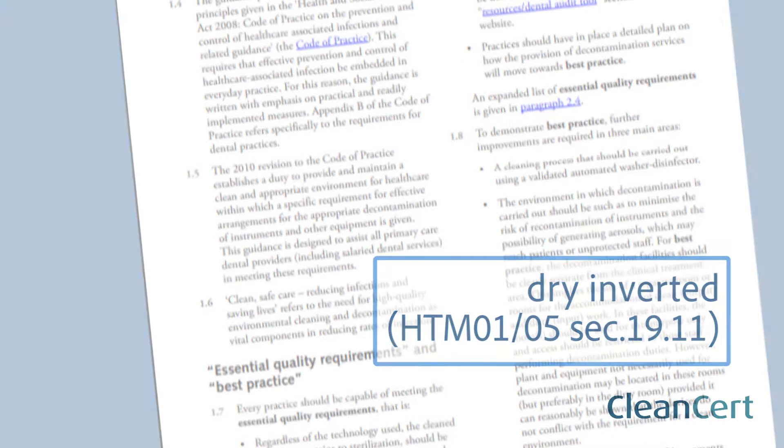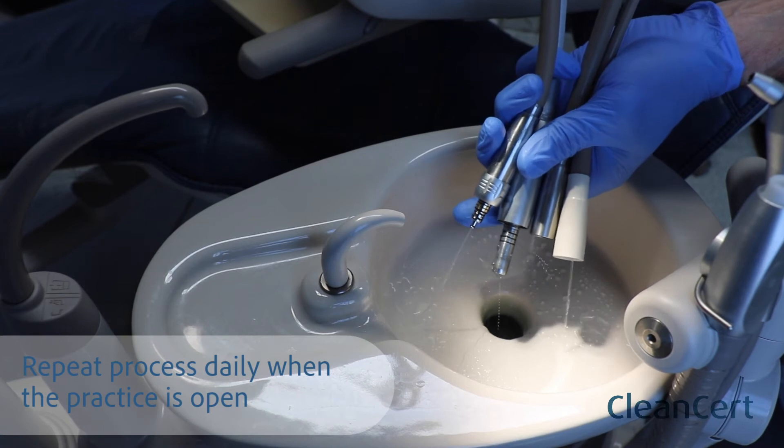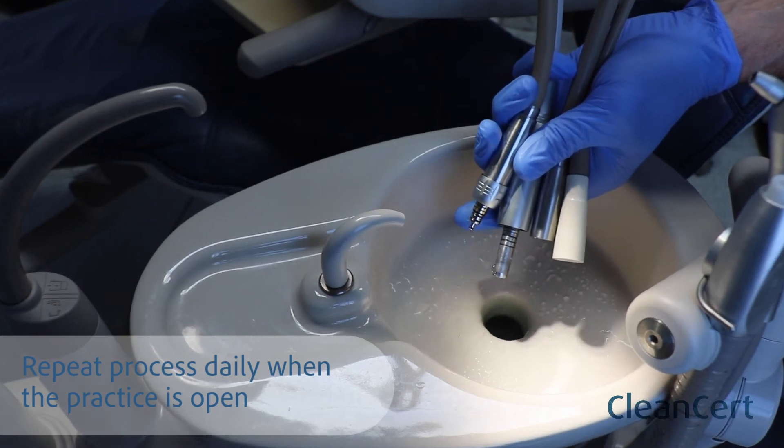Finally, purge water lines of any remaining liquid and allow to dry overnight. Repeat the process daily when the practice is open.